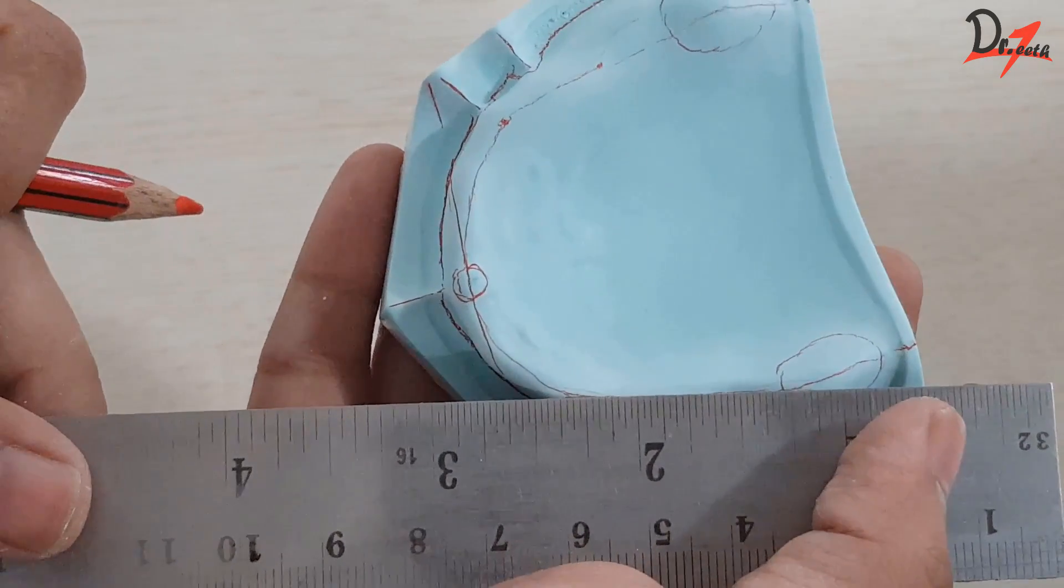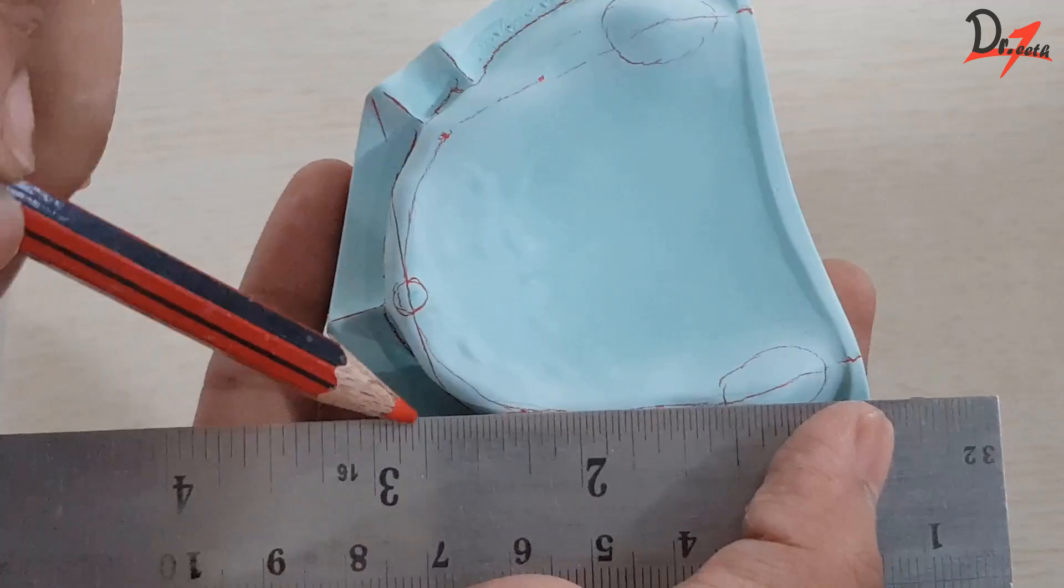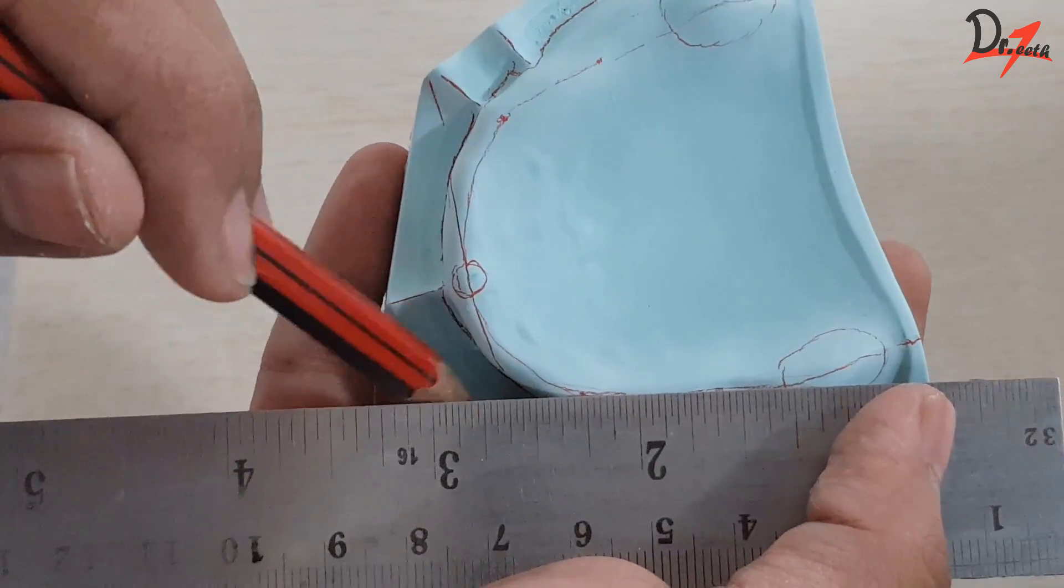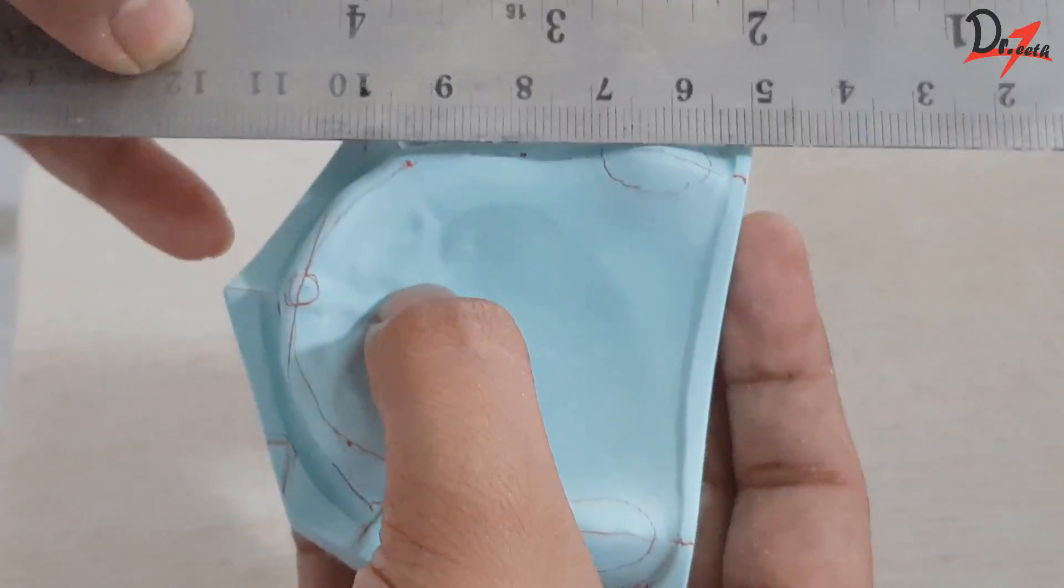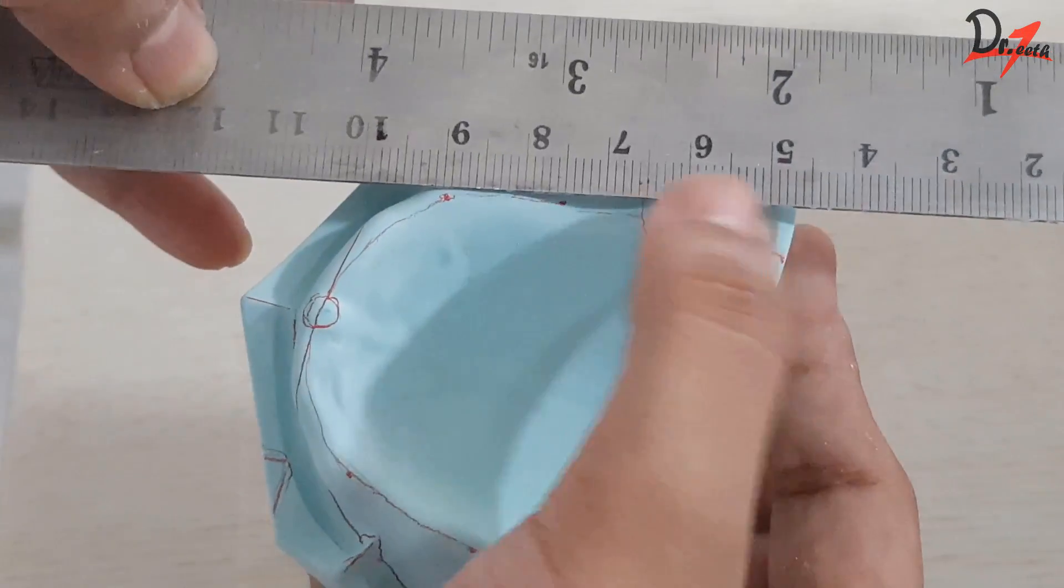Now what we have to do, we have to extend this line on the anterior surface of the cast. And we have already extended that line on the posterior surface of the cast.